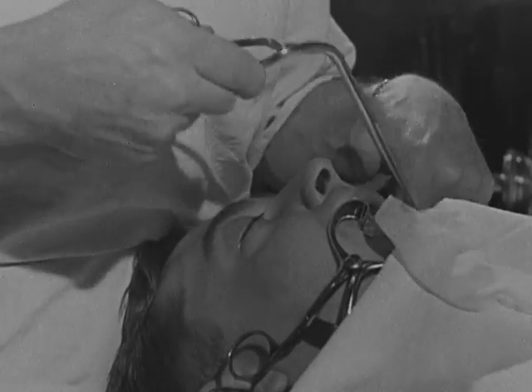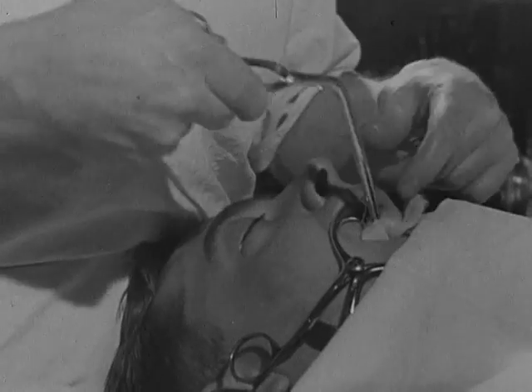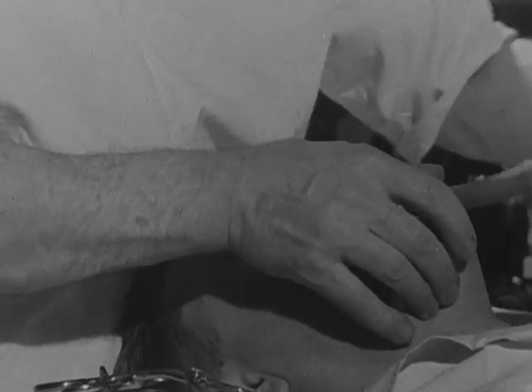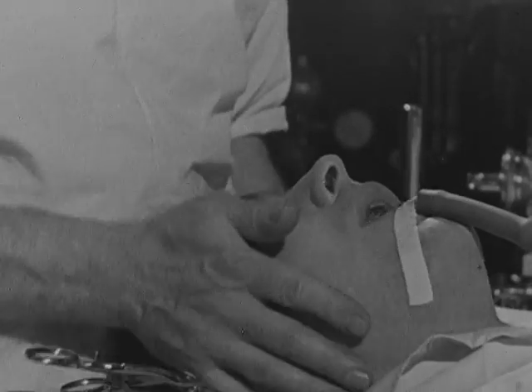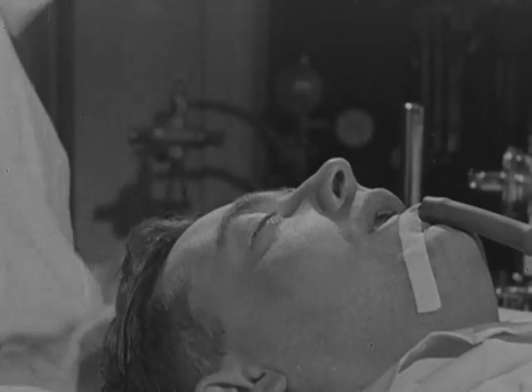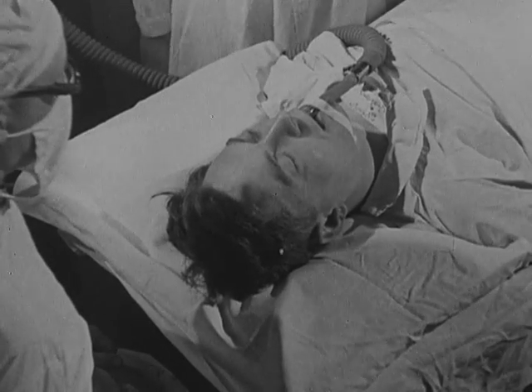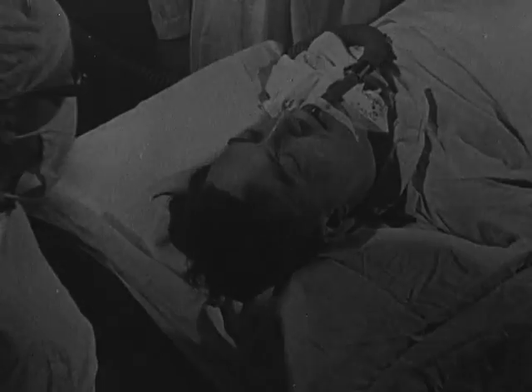This method of packing is more satisfactory than putting in packs behind the soft palate and is less likely to lead to injury. No blood can now reach the trachea, and the packing also makes sure that breathing takes place entirely through the tube.